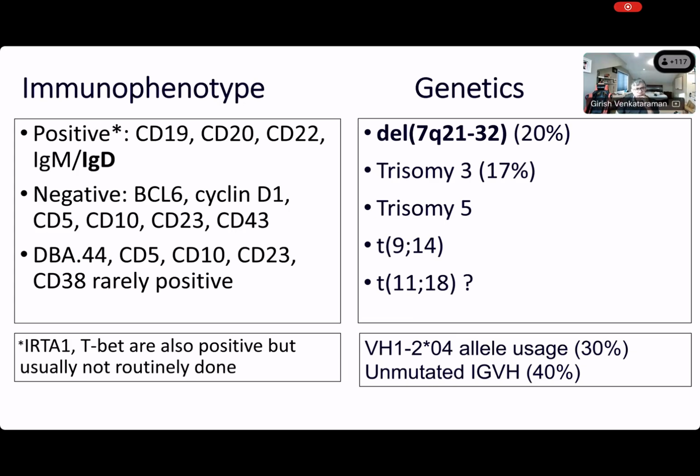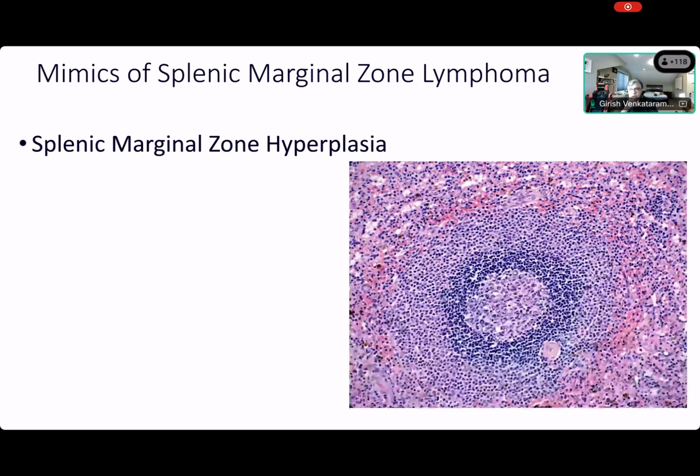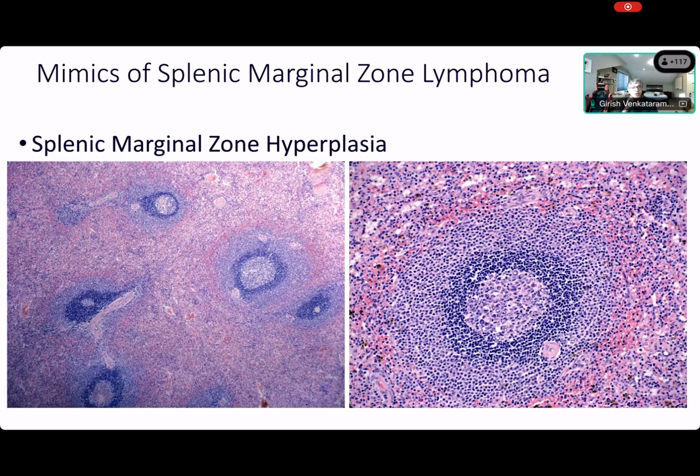And if you have a flow, you can make the call. But if you just have a biopsy and a sinusoidal CD20 pattern, you pretty much have a diagnosis. And of course, what are the mimics? Marginal zone hyperplasia can do that. That looks exactly like the lymphoma I showed you earlier. It's marginal zone hyperplasia. And again, you have to use context, right? They look very similar to lymphoma, so you have to be very careful about not calling marginal zone hyperplasia lymphoma.